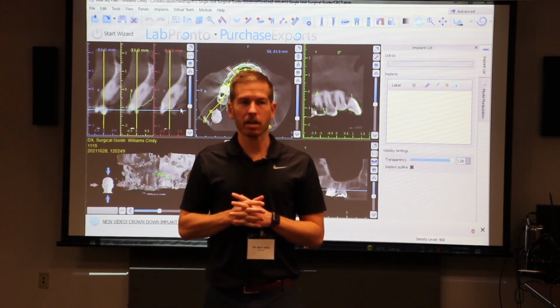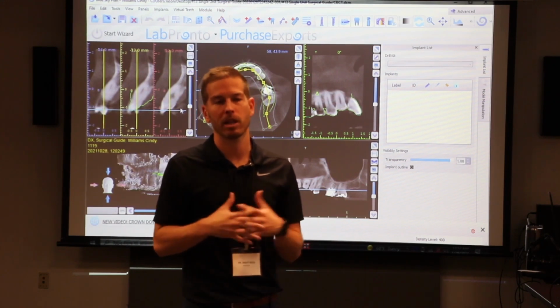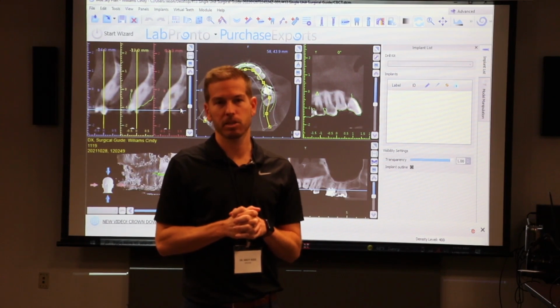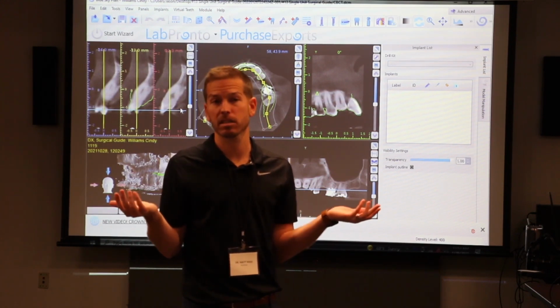That is a complex topic because taking those high scatter cases requires a different way to align it, and that's where the scan appliance can come in. So if you guys ever heard of the dentures with the radiographic markers, it's because they don't have teeth to align.